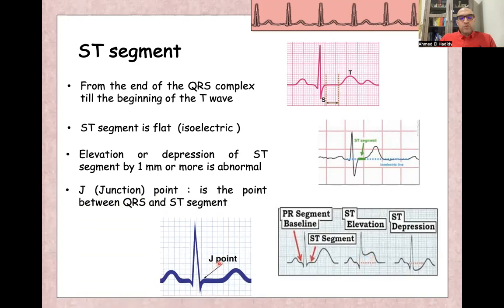We have what we call J point. J point is a junction point between the QRS complex and ST segment. Exactly this point, what we call junctional or J point.